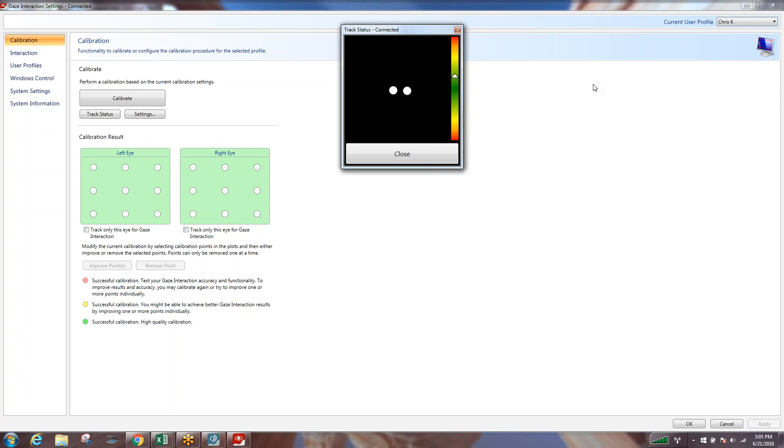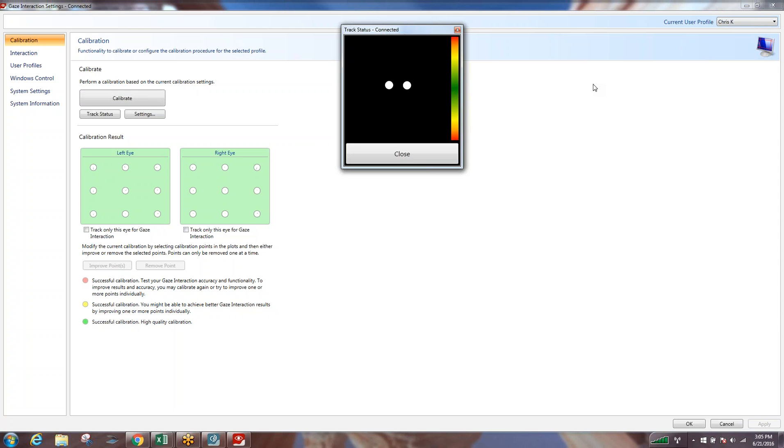Once you get the white circles in the middle of the black box, the next thing we want to do is look at that white triangle in the colored bar on the right side, and you'll see that as I move too far away or too close to the unit it goes to the yellow and into the red. Our goal is to get that white triangle right in the center of the green if we can. That tells us we're about 18 to 24 inches away and now we've accomplished both a good distance and a proper position for us to access all areas of the screen.